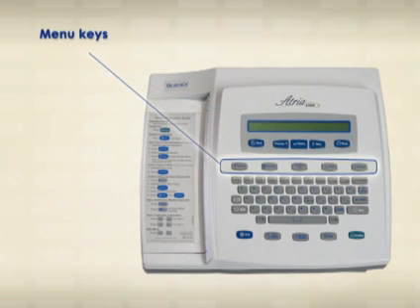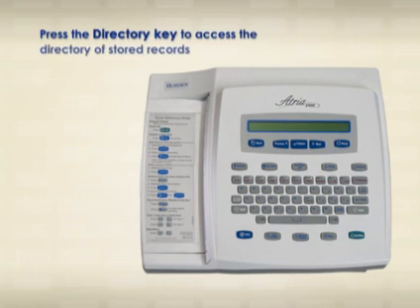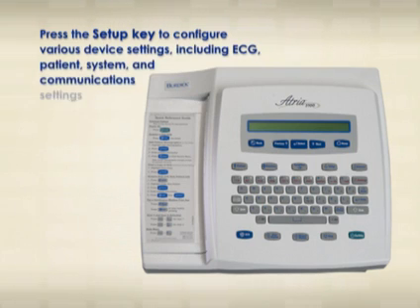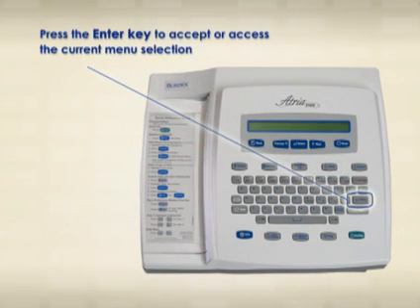The menu keys allow you to enter patient information, access a directory of stored records and communication options, and configure device settings, including ECG, patient, system, and communication settings, as well as basic input functions.